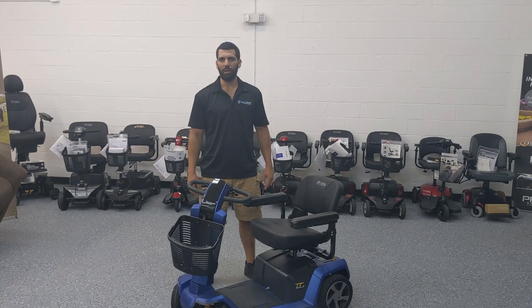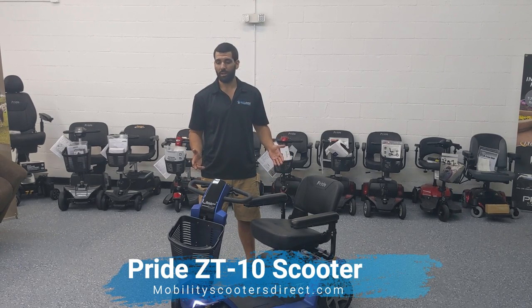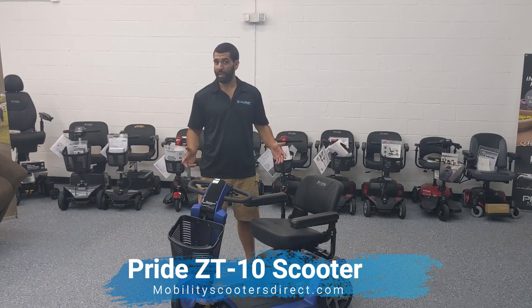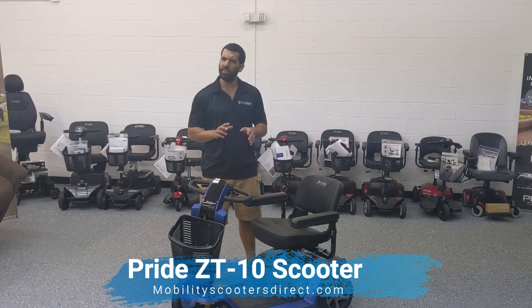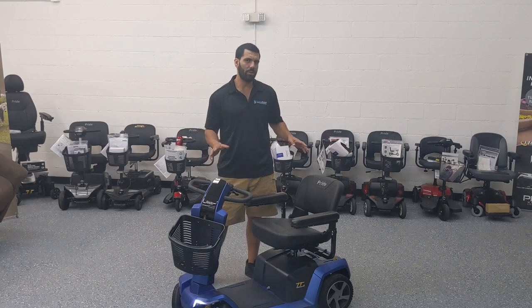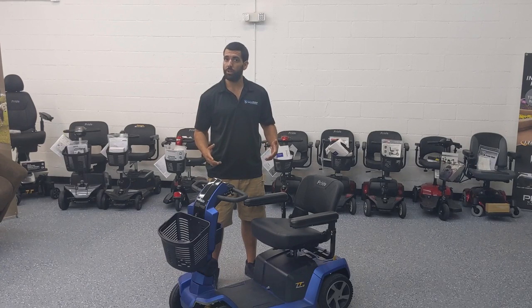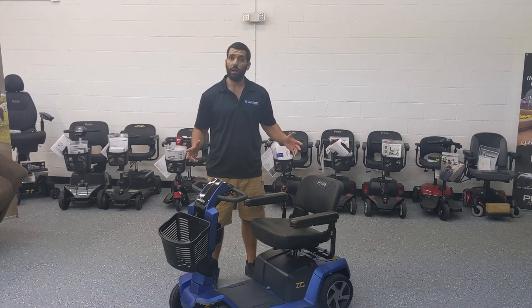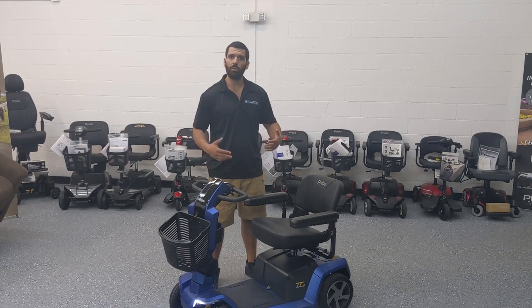Hi everybody, I'm Sergio from Mobility Scooters Direct, here today to show you the Pride Mobility ZT10 Mobility Scooter. This is one of Pride Mobility's latest products. It was released in late 2019, early 2020. They first announced the ZT10 at MedTrade — we were able to get some video and pictures, which you might have seen on the product page or our blog. But we finally got one in the showroom and wanted to demonstrate how it works, how to take it apart, and show you some of the features.